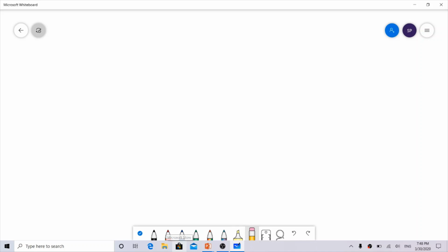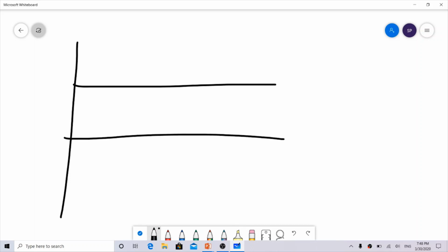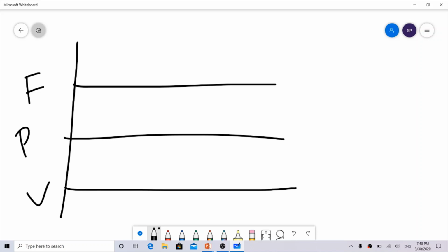So again, now let's get to this. We have something known as flow, something known as pressure, and we have volume. So what was the PEEP? The PEEP was plus 5, so this is, let's say, here.